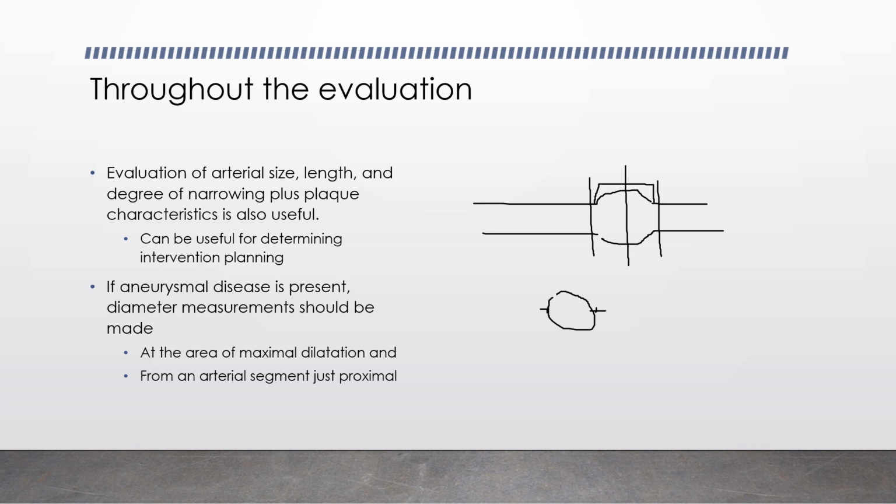So when you add color, you want to make sure that your settings are appropriate, because we want to see that that aneurysm should be demonstrating turbulence throughout the whole vessel. Sometimes an aneurysm can develop a thrombus in one area of the vessel, and stop blood flow from entering that area. So utilizing color flow in this image is going to be essential to determine if the lumen has thrombus in it or if it is free of thrombus.